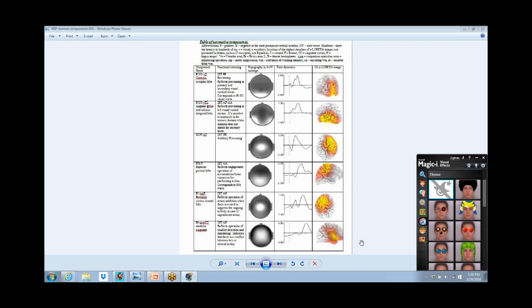When Z-score training came out, as soon as it came out as a possibility, I expressed concern over Z-scores when the tuning of the brain activity was very far out of the traditional bands, because you're getting Z-score feedback for banded activity.